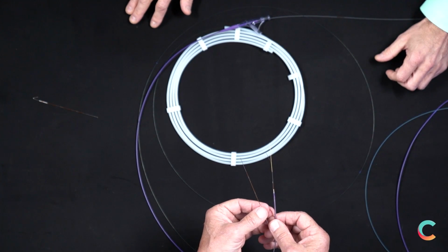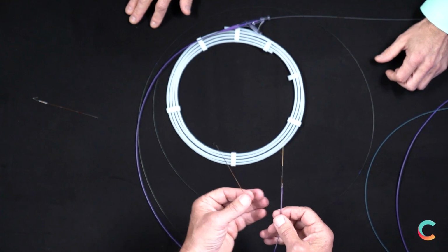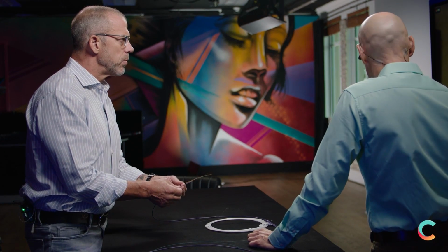The customization of things, you being able to expand your skills. What comes to mind when you see this? Well, I see it as multiple applications for that adapter. So now I can take a balloon catheter that has one usage, inflate a balloon. Now I can add an adapter to it, which could be multiple, and I could add an imaging section to it. I could use a scoring section. I could use a blood clot removal section.